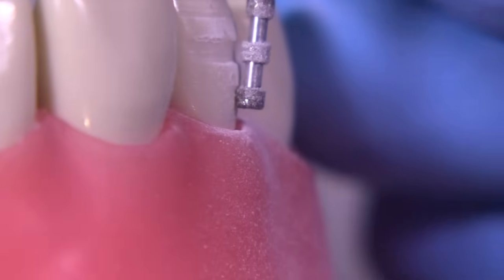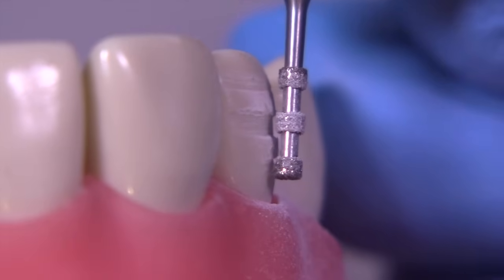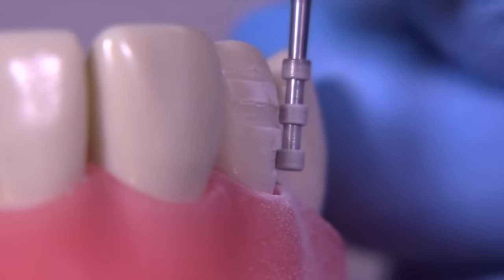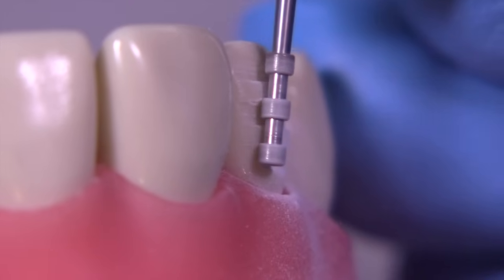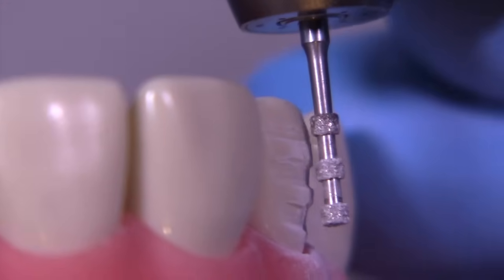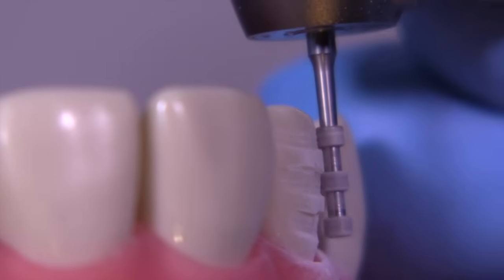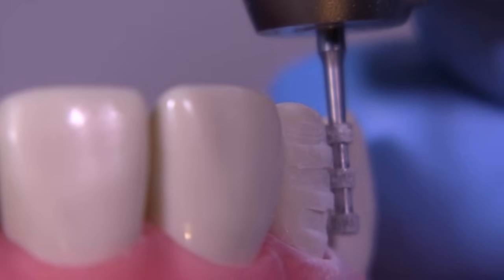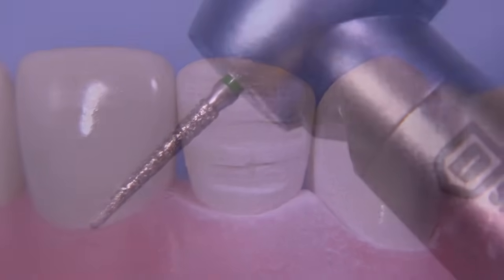You notice how I hold this in the middle third. Now if I want to get the depth cut at the gingival third, I have to tip the burr so that it's parallel to that gingival third. And you can see how the middle third isn't really cutting, it's just the gingival third that's cutting. And we'll get that 0.3 millimeters that we require there. And then we can tip the burr back the other way towards paralleling the incisal third of the facial to get the incisal depth cut. So the burr can be used really easily and very quickly to get the proper reduction that we're looking for.